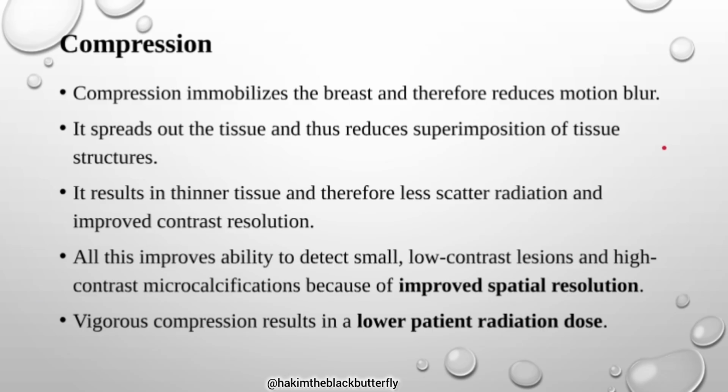And if the breast is not compressed and you're positioning it on the breast support, it will always be moving around. If you image when the breast is moving around, you're going to get motion blur artifacts in the final images, and we don't want that. So we compress the breast also to immobilize it, such that it remains in one position and then imaged.